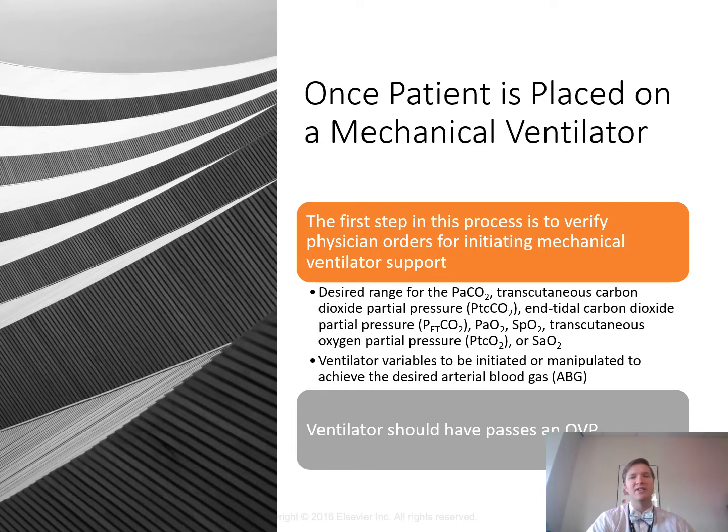The OVP is usually the policies and procedures that the respiratory therapy department has. So it's important that the respiratory therapy department maintains records showing the OVP history for each ventilator. Most ventilators will have a record showing what changes, what procedures, what tests have been done, which is a lot easier nowadays. In addition, there should be a label or a form attached to each ventilator showing when the OVP was performed, who did it, and whether the ventilator passed the multiple part test. A lot of times this is recorded on the ventilator, including the last time it was done.